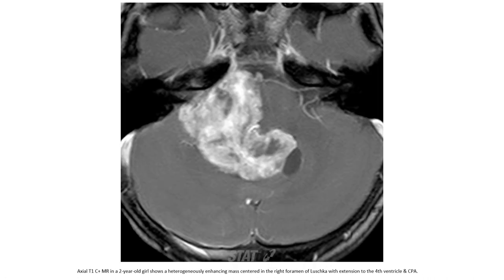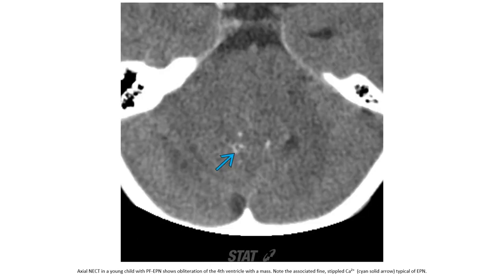This is T1 with contrast in a two-year-old child, showing a heterogeneous mass centered at the area of the foramen of Luschka, which extends into the fourth ventricle and CPA cistern. This is a non-contrast CT in a child with posterior fossa ependymoma, showing obliteration of the fourth ventricle with a mass and associated fine stippled calcification, typical of ependymoma.